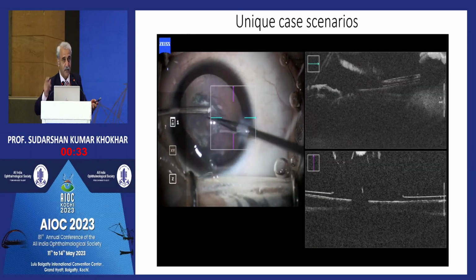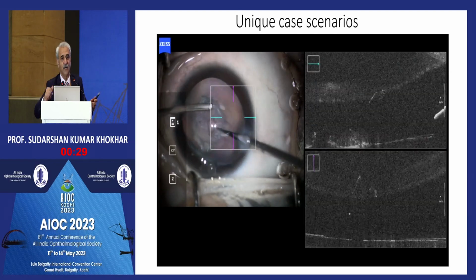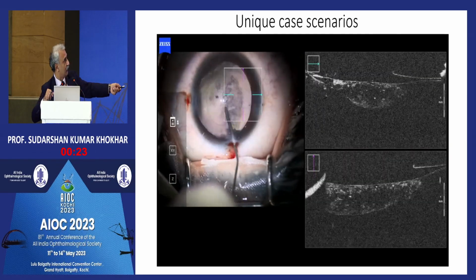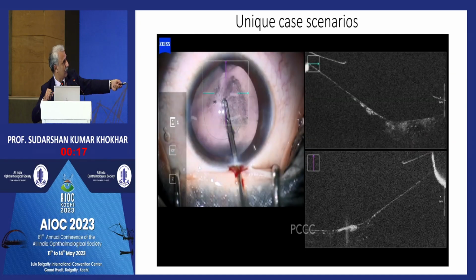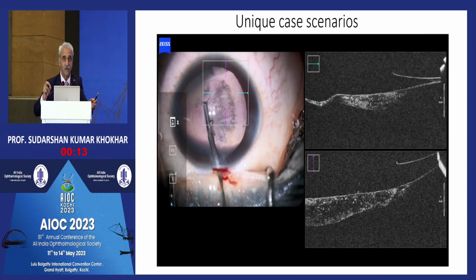So, judging the thickness of the membrane on the OCT, you can either use a blade or you can use a Rexis forceps, or you can just peel it off. So that actually gives you an idea. So this was case number two, in which again there's a membrane in the back, and we made an opening and put Healon behind it, so you can see it's bulging up there, and we could do the Rexis in this one.